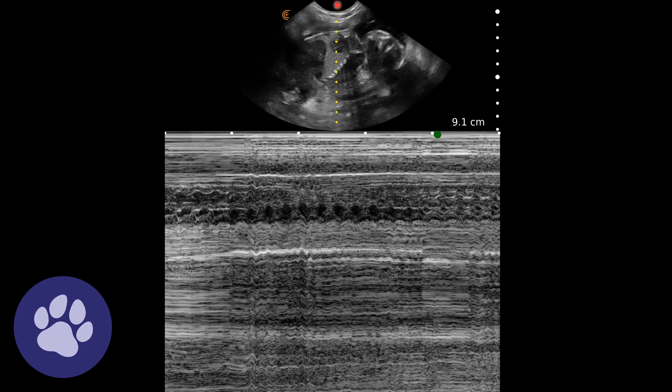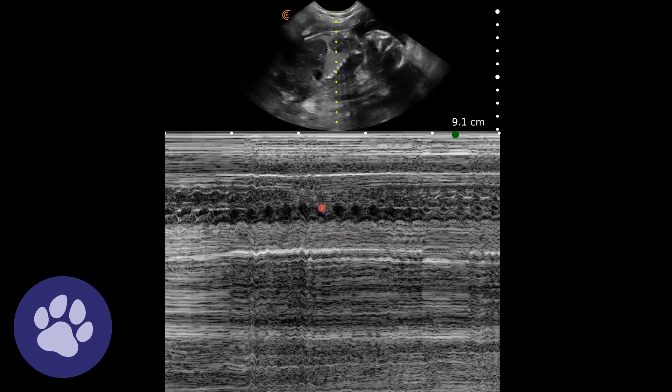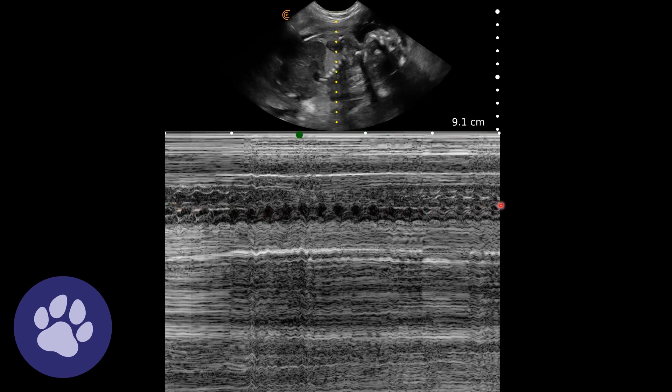Here we've placed M-mode — this straight line — over the heart, and we can see this line along here which represents time as we move along. We can see this marker moving along the top registering the time. We can really see that heart beating as we move along in time.